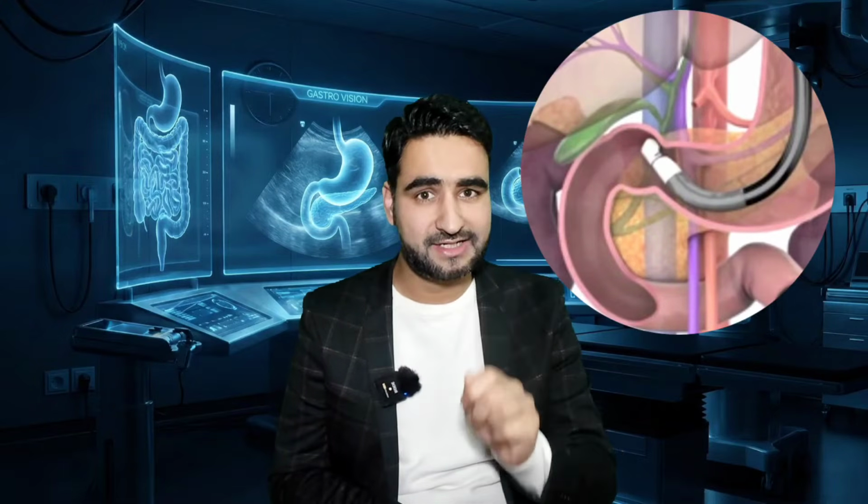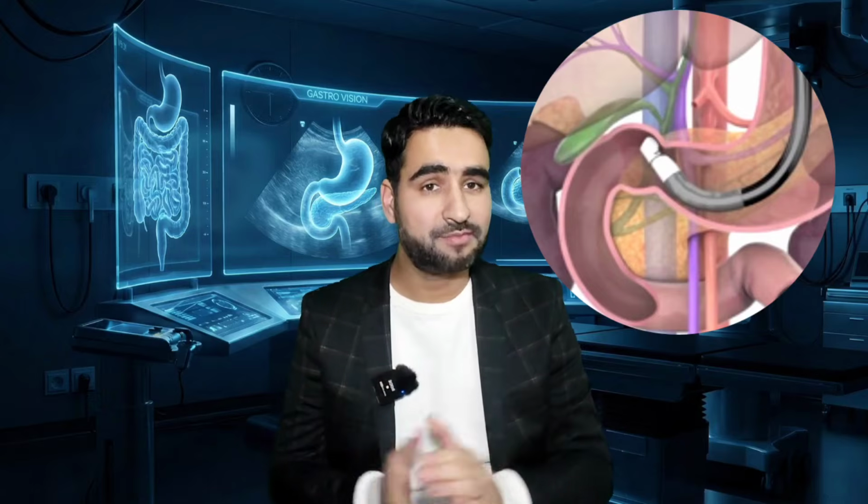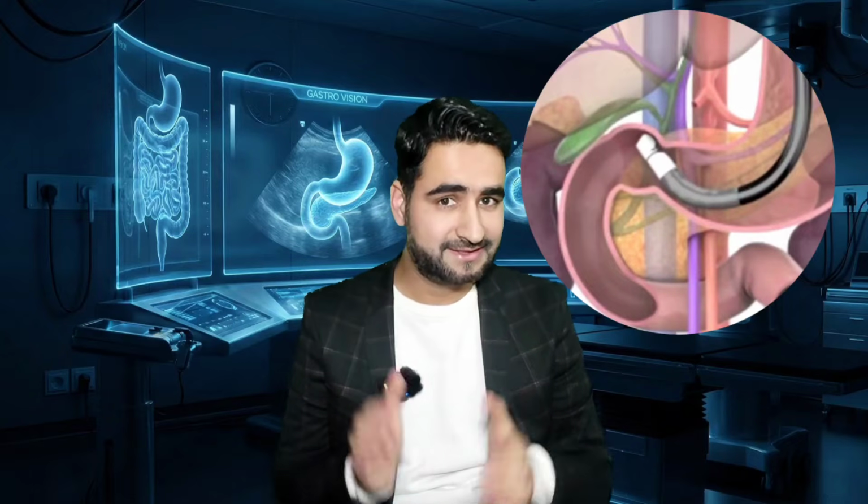The structures in the duodenal bulb are best appreciated in the long loop position. What does this mean practically? After entering through the pylorus, you may need to give some extra controlled push to achieve optimal positioning. You are not just sitting at the pylorus, you are advancing beyond it into the duodenal bulb itself.